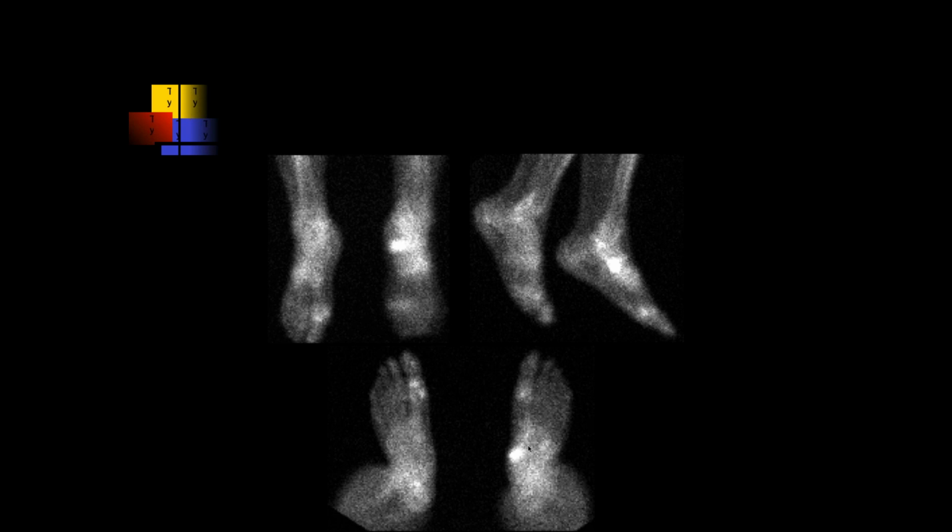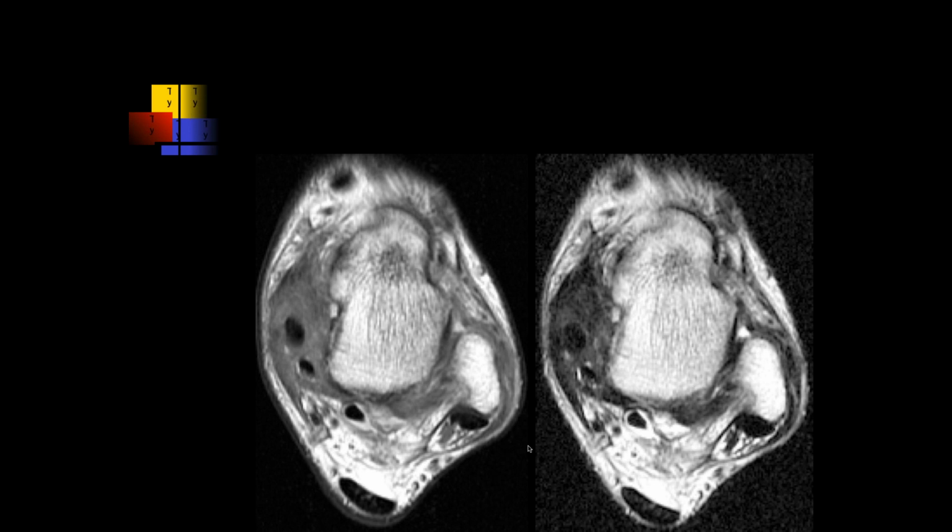I'm sorry. Can you go back? This is synovitis and maybe a little granulation tissue. Yeah. If you had scarring here, the tendon wouldn't move, would it? Yeah, probably wouldn't move much. That's right. So this ankle would be basically frozen. That's the only way I could look at that.